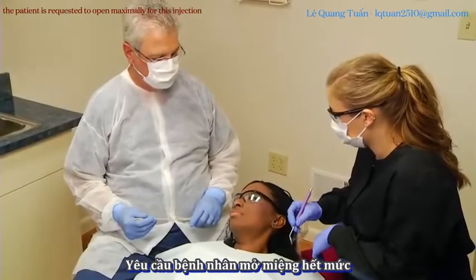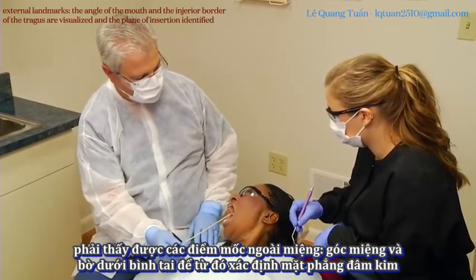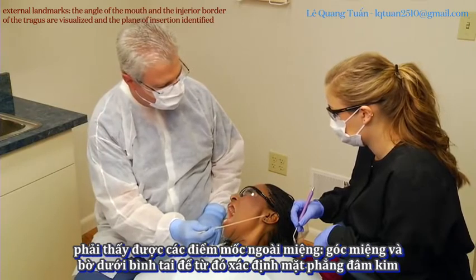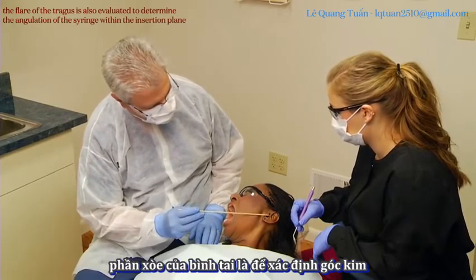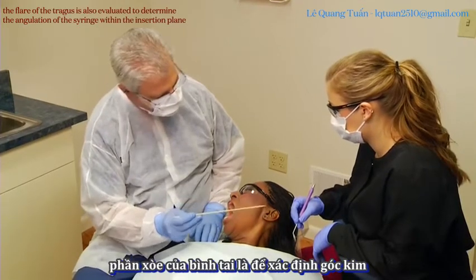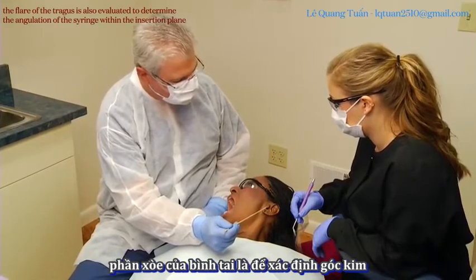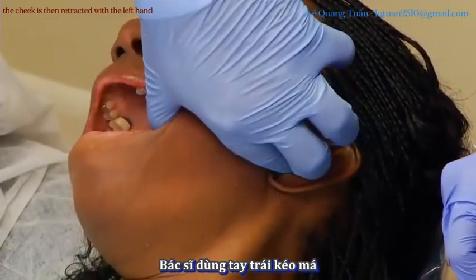The patient is requested to open maximally for this injection. External landmarks, the angles of the mouth, and the inferior border of the tragus are visualized and the plane of insertion identified. The flare of the tragus is also evaluated to determine the angulation of the syringe within the insertion plane. The cheek is then retracted with the left hand.